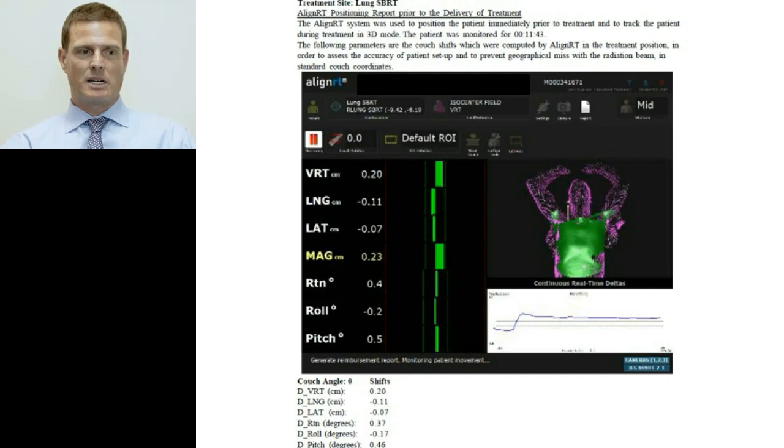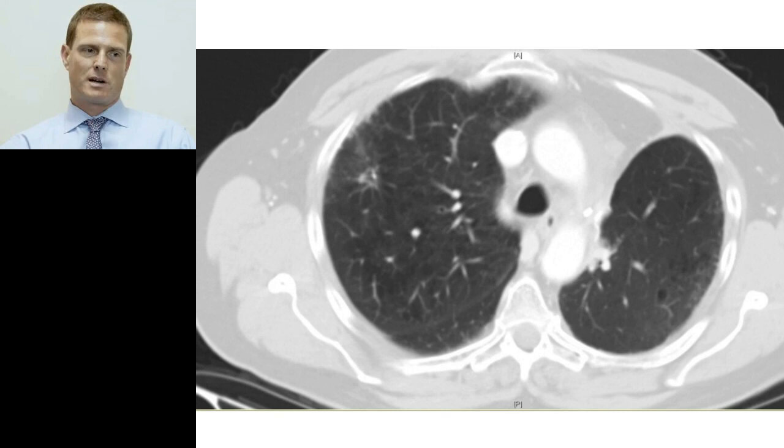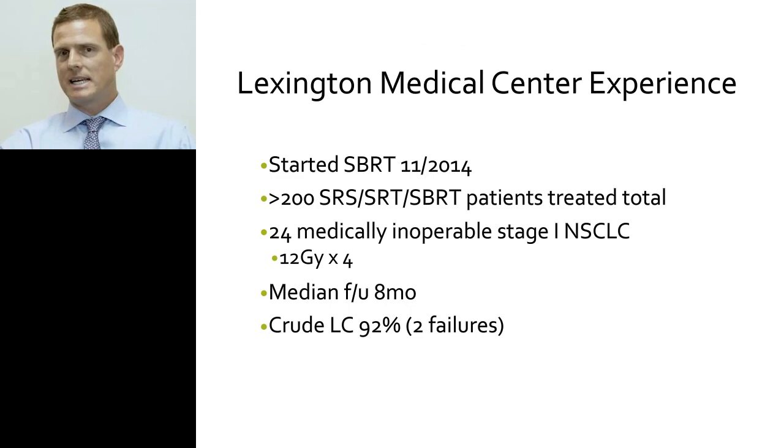And at his most recent CT scan, you can see he's got some volume loss from his left lobectomy, but in his right lung there's some scar, but he has certainly no evidence of disease progression and the beginning of disease response. So this is not an academic center, and I know this is not a fully rigorous academic evaluation, but we did take a look at our community center results.